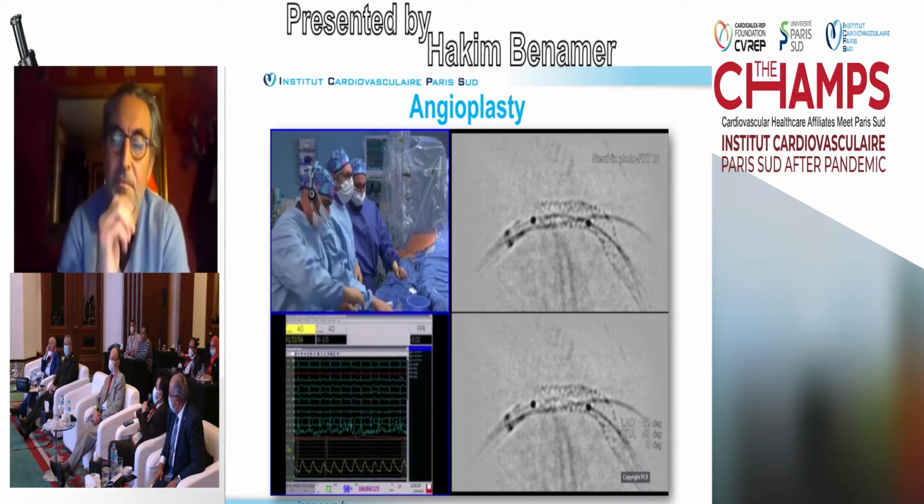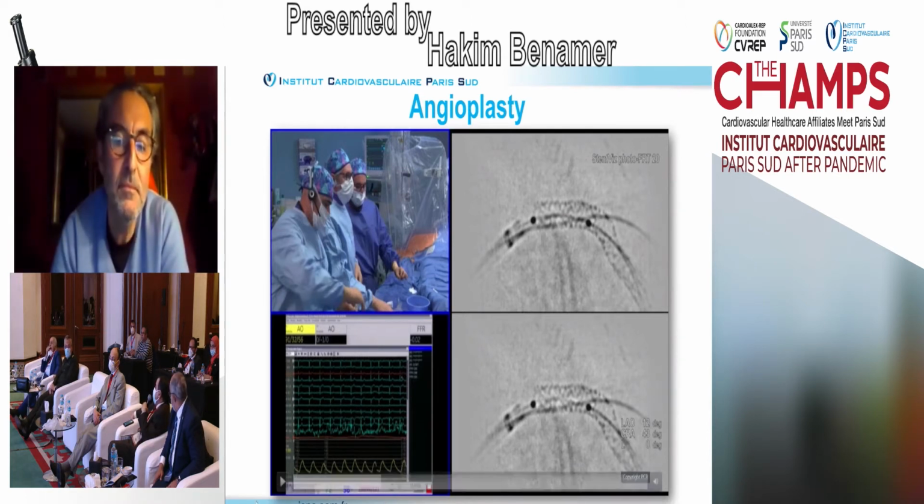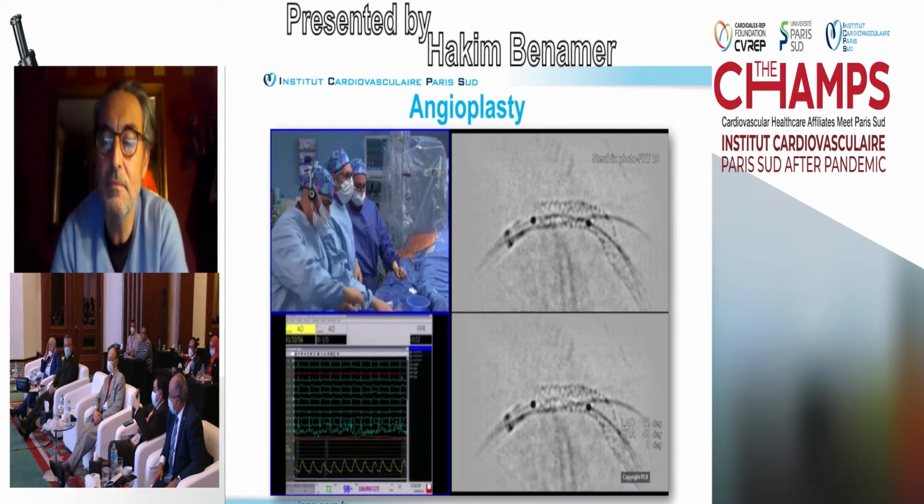Most of the time I use an NC balloon for preparing the lesion. NC, you prefer? Yes, NC. Okay.